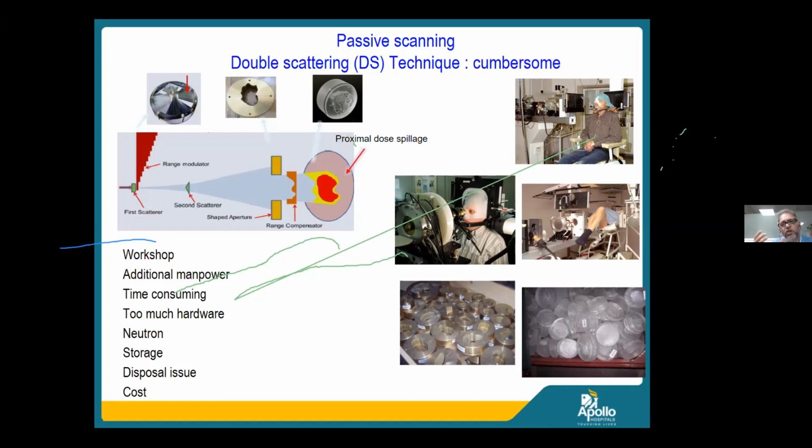And although the technology was there, because of different factors, it did not become popular. Added to it also was a relatively cumbersome modality. The whole paraphernalia which was employed to deliver this proton beam almost reminds you, in a joking manner, of a 1970s, 1980s Star Trek type of environment. You know, you have all the contraptions, the fixed beam. This is, by the way, a melanoma of the eye, which was among the first ones to be treated because it was a pinpoint accurate treatment, but you needed very small energy to treat, and you didn't need too much of the spread out Bragg peak. And this was employed in different centers. The indications were relatively small.